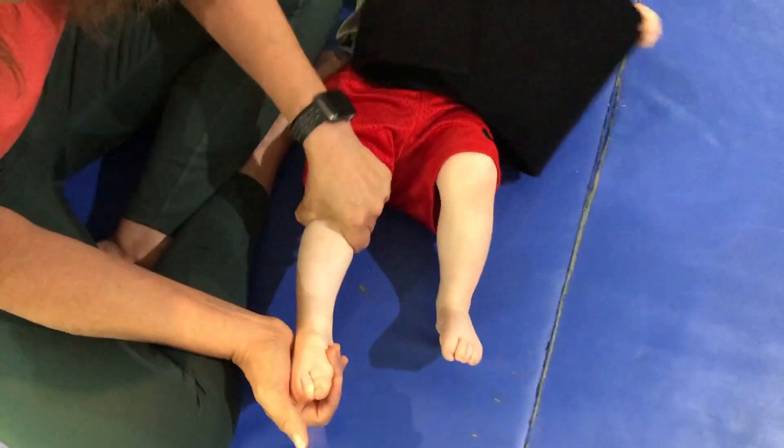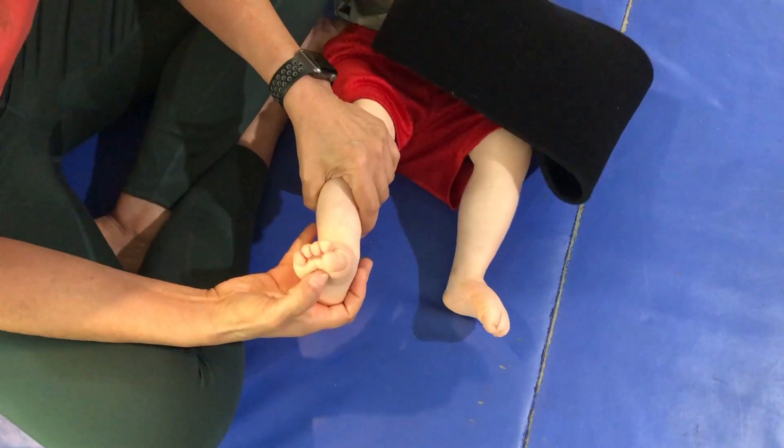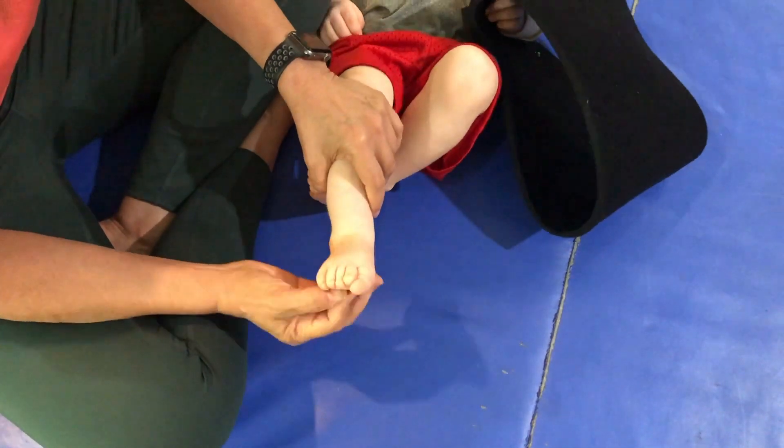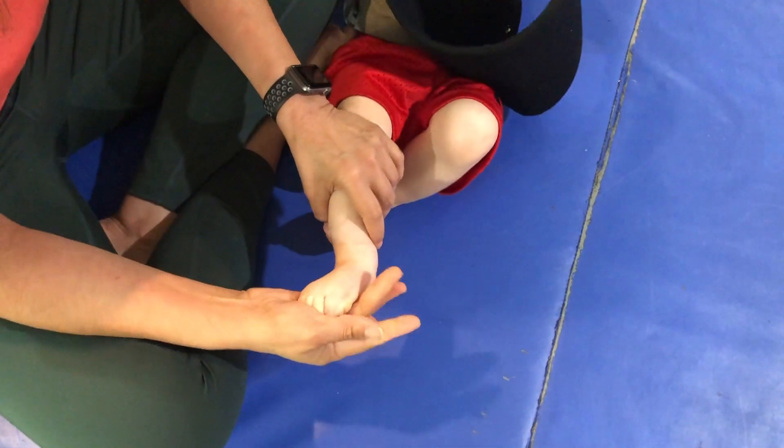Having a brace is going to shut off this muscle early because he's not walking yet, and if he has the plantar grasp reflex, a brace that comes in here is going to make him curl his toes more.